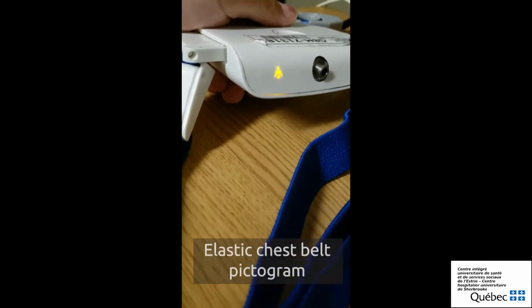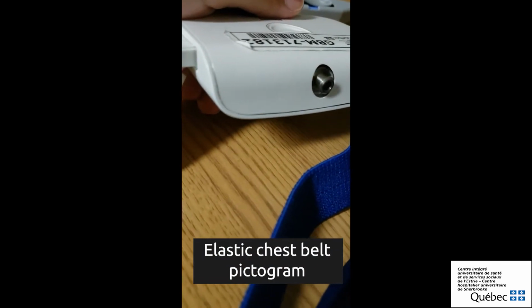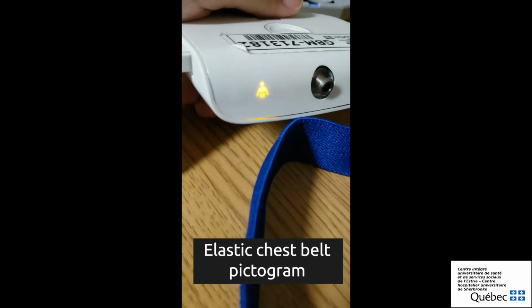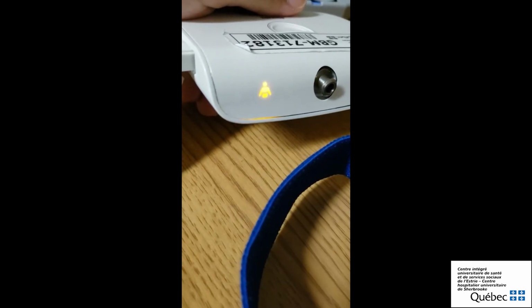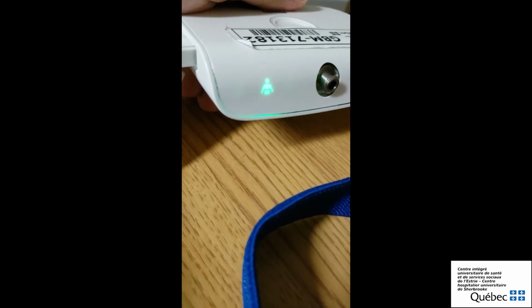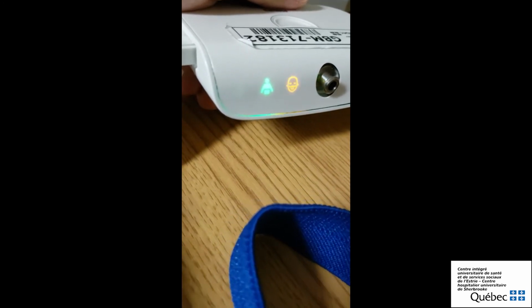Here we see a little man with a chest belt flashing yellow. The chest belt is used to record your chest movements while you breathe. When it is yellow, it is a sign that the machine is not picking up your breathing movements. When the machine is able to pick up your breathing movements properly, the light will become green.